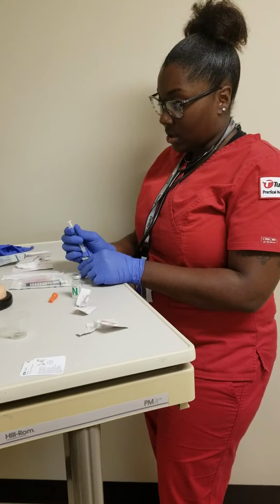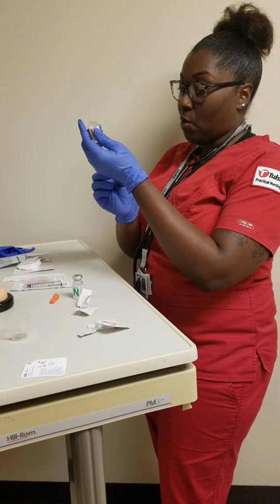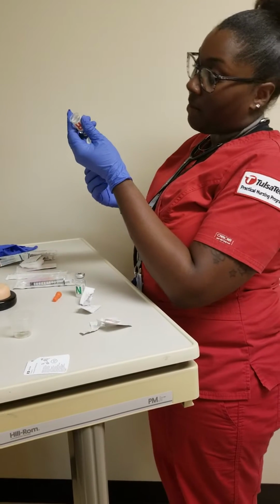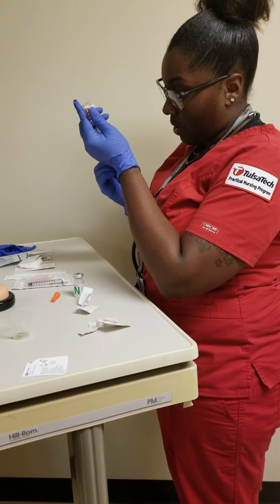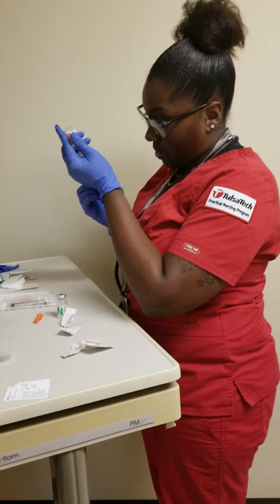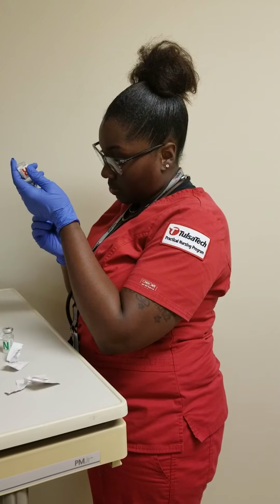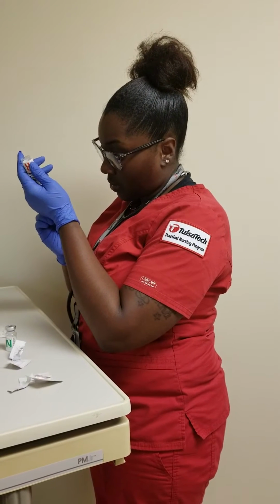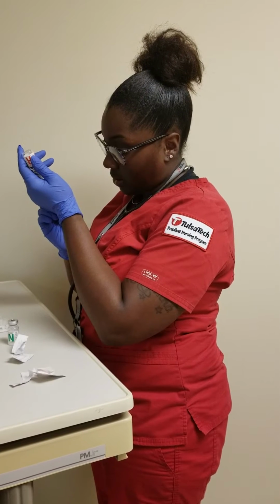I would not inject air because I have the other insulin in here and I don't want to contaminate the vial. So I will slowly get my other 5 units out of here, trying to go as slowly as I can so that I don't go under or over the desired dose.